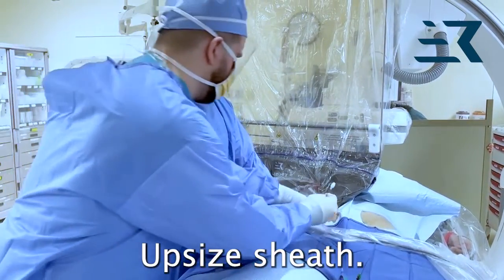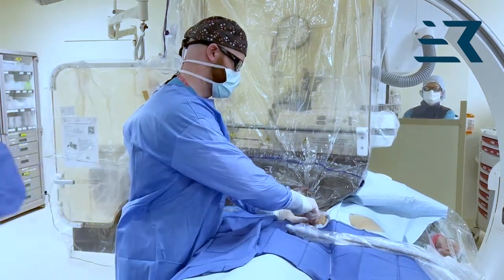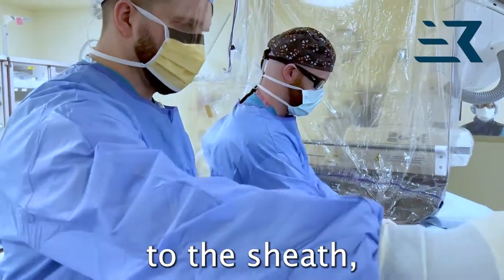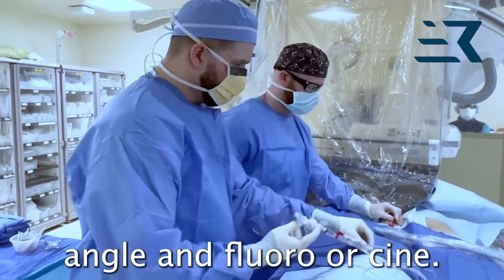Upsize sheath. For femoral access angiogram, attach extension tubing to the sheath. Pan table under the II. Obtain camera angle and fluoro or cine.